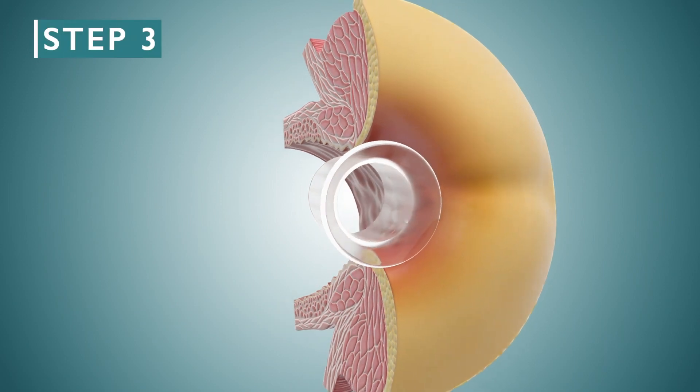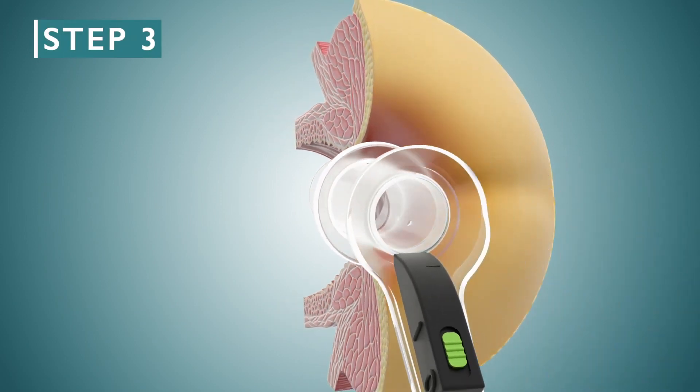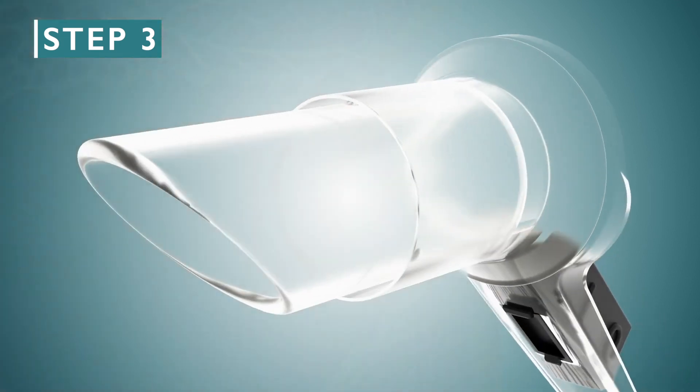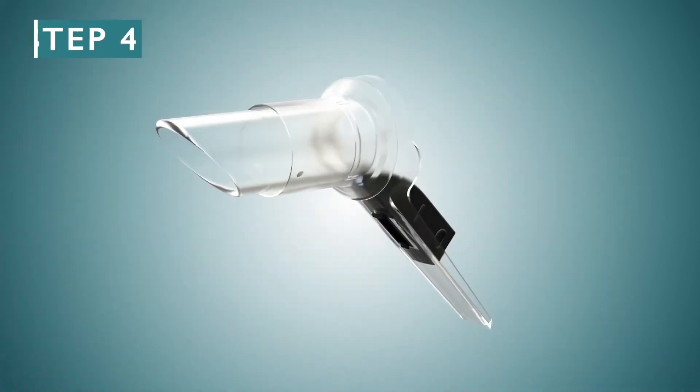Step 3. Insert the main body by aligning the locking system on the main body and sleeve, then turn on the LED module. Step 4.